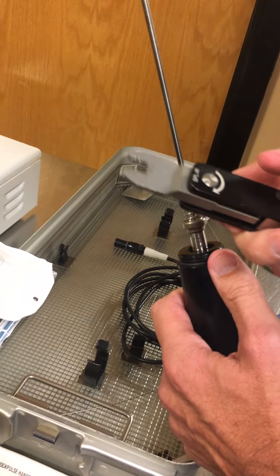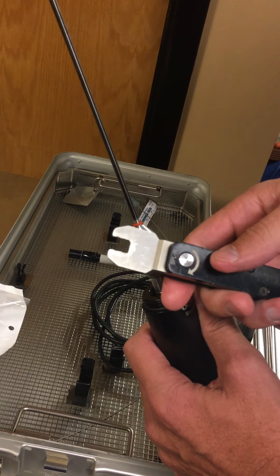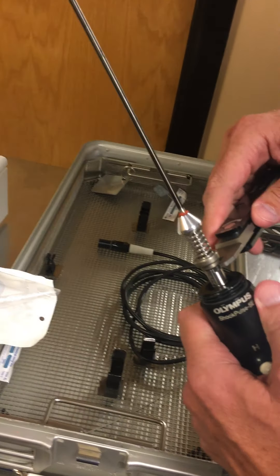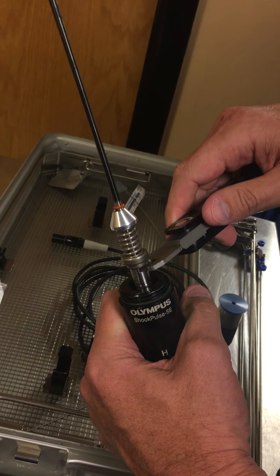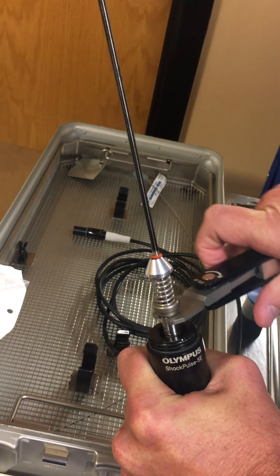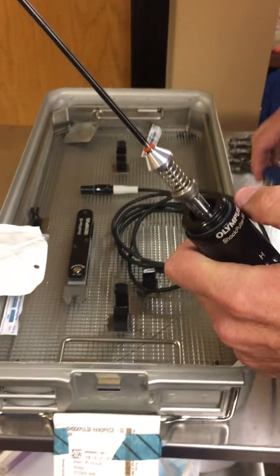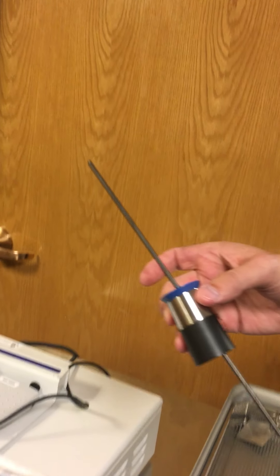With sterile gloves on in the sterile field, take the wrench. This is a torque wrench, which means once you've applied enough pressure the wrench will release. It has an arrow indicating the direction to go for proper pressure. Slide it onto that portion of the probe, tighten, and you'll feel the wrench release — so it's tight.